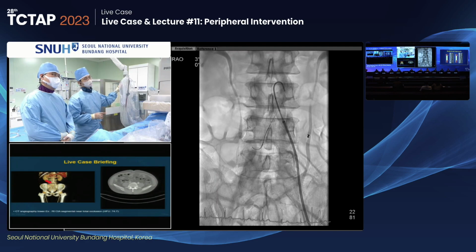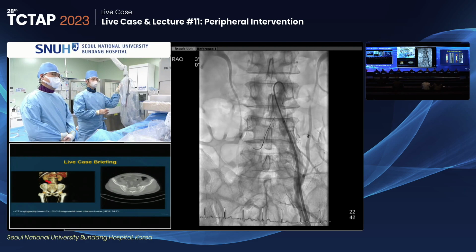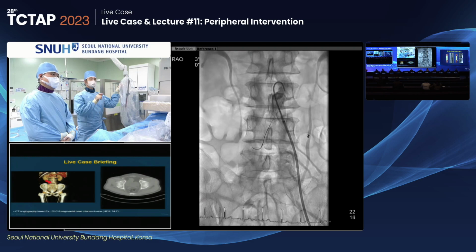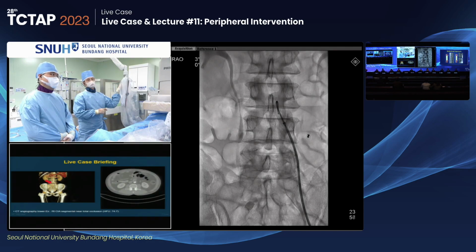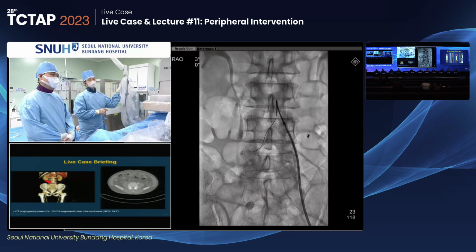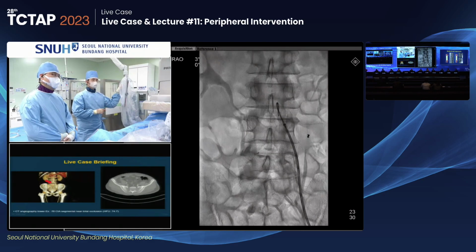You can find the distal part of the wire touches the distal stump, and I would like to penetrate the distal cap. So I changed the wire to an Astato 20 014 wire, hoping that the wire can penetrate the lumen well.